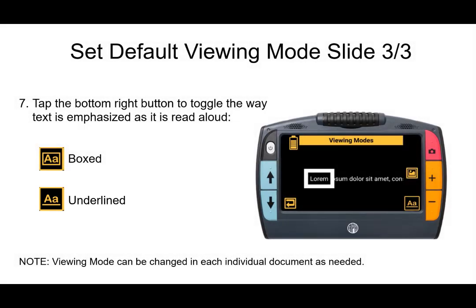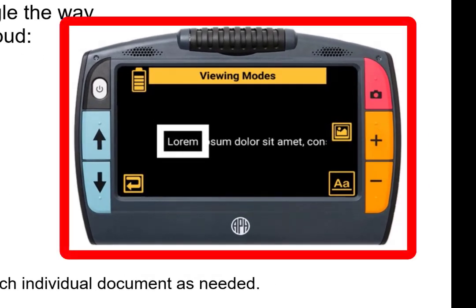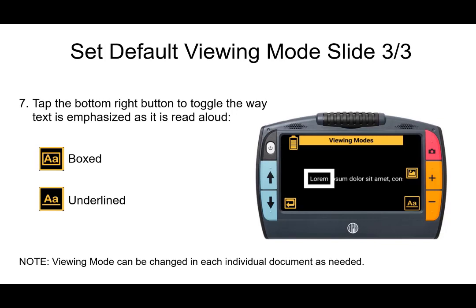As an FYI, this is what ticker tape mode looks like in the example shown — one line of text at a time. And as a reminder, your viewing modes can be changed in each individual document if you prefer them different than the default setup.